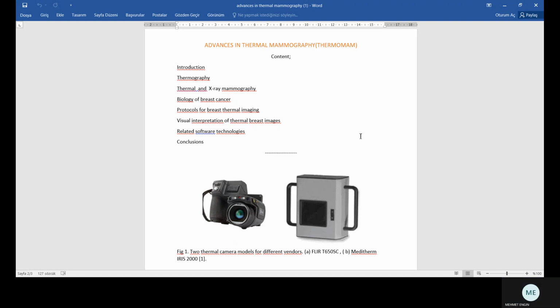First aspect, auto-tagging. Since one single view may not be sufficient to capture the tumor region in different parts of the breast region, multiple views are taken. Typically, there are 5 thermal images in multiple views that are captured. One of the common mistakes made by clinicians is naming the image wrongly. It's observed that many times humans are confused with the classification of right and left sides of the breast in the image correctly, resulting in improper tagging of lateral or oblique views.